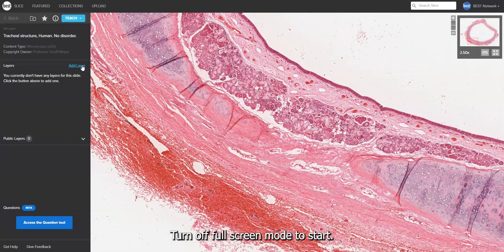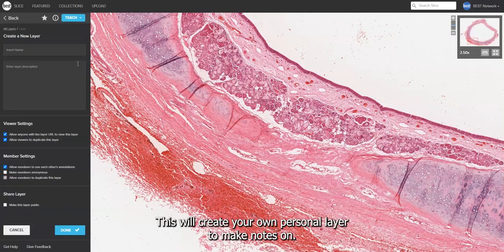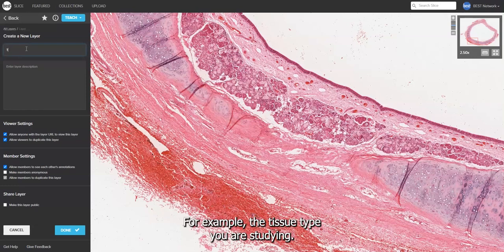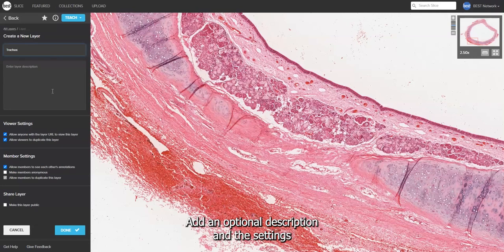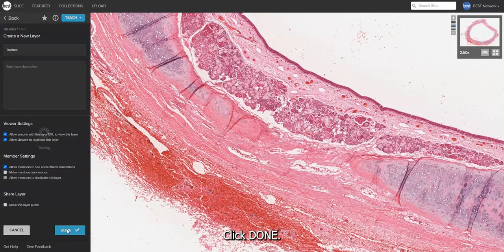Turn off full screen mode. To start, click Add Layer. This will create your own personal layer to make notes on. Give it a title, for example the tissue type you are studying. Add an optional description — the settings are preset for you for this type of activity. Click Done.